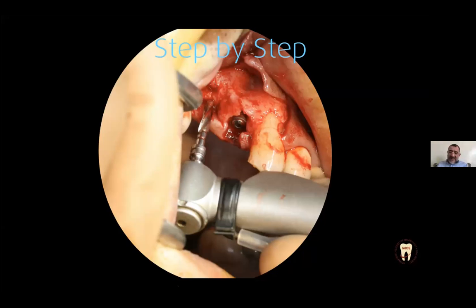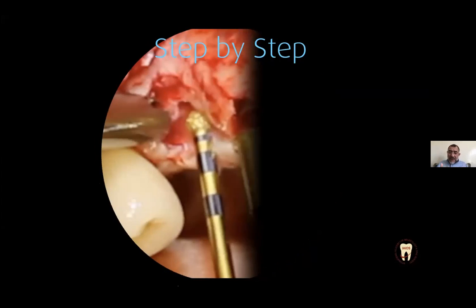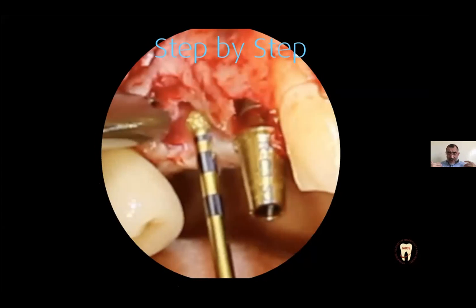You leave 1 millimeter of residual bone against the floor of the sinus, and you change the tips, and you use the piezoelectric tips, and you remove the residual bone against the membrane, and you have the sensation that you are in proximity of your membrane. You use this instrument, and you remove your bone gradually to have proximity of your Schneiderian membrane.